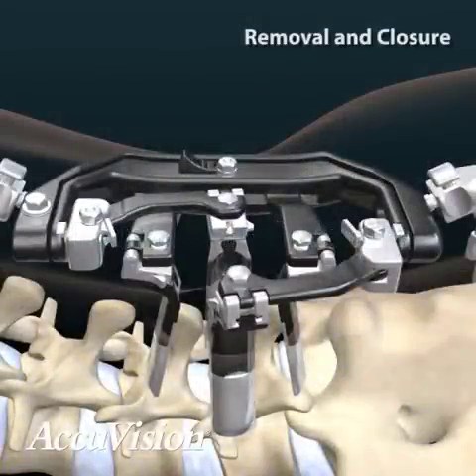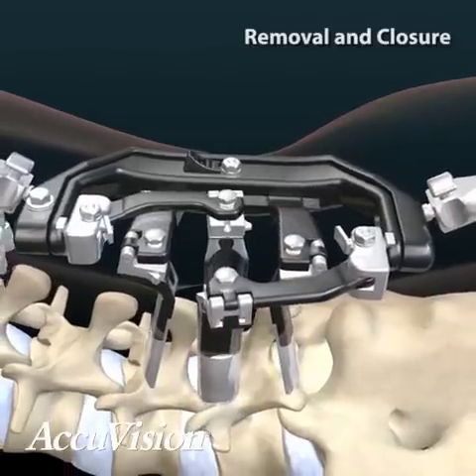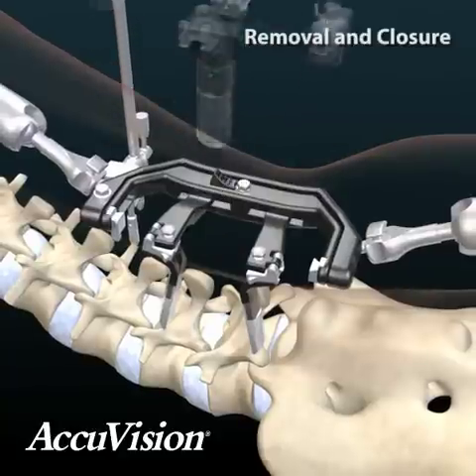Upon completion of the surgical procedure, the retractor frame is removed from the surgical site. Any airplane angulation of the frame is reduced to a neutral position. Shim extension, distraction, and angulation of the medial and lateral retractor arms is reduced, and the retractor arms are removed from the surgical site.